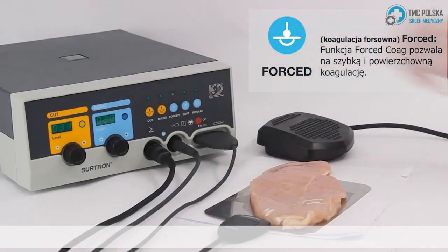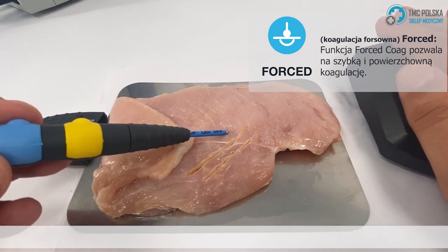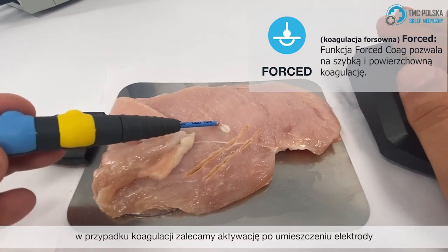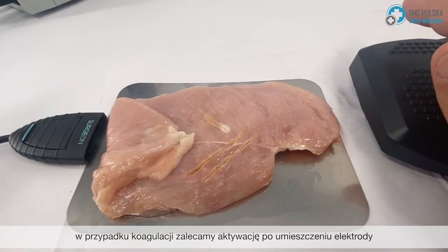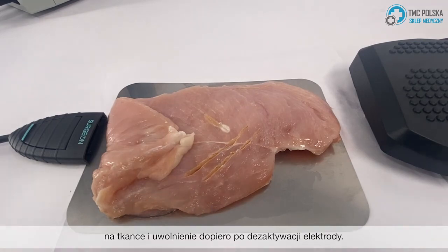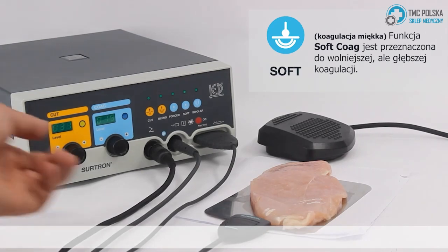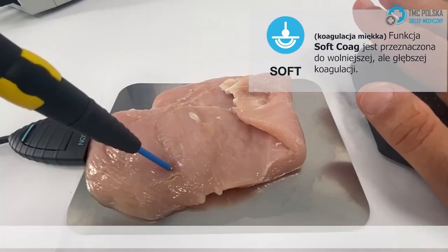Forced coag: this function allows for a quicker and superficial coagulation. When using coagulation, we recommend activating after you've already placed the electrode onto the tissue and releasing it only after you've deactivated the electrode. Soft coag: this function is meant for a slower but deeper coagulation.